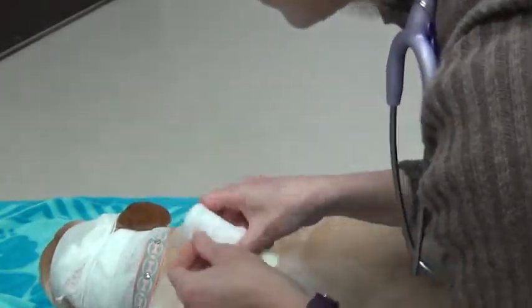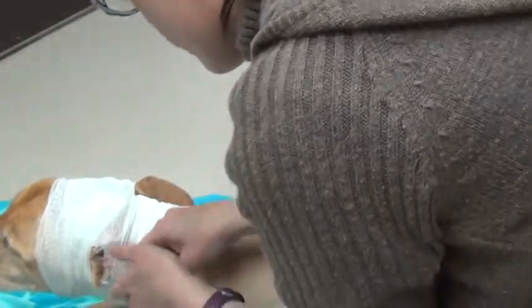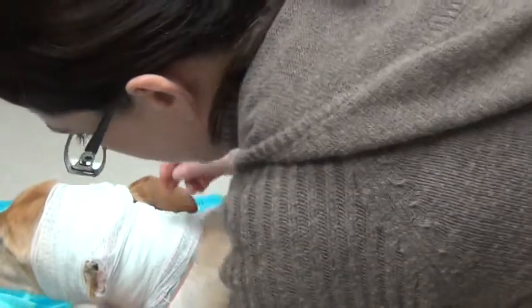We'll do that just to give her some extra pad in there. So your other ear is still sticking out, still exposed. Daisy's very bored with this. It's okay. I'm just going to put one more layer. I'm still avoiding and covering up the ear. Being a good girl. So under and over that other exposed and open ear. Alright, sweet girl. Very good.